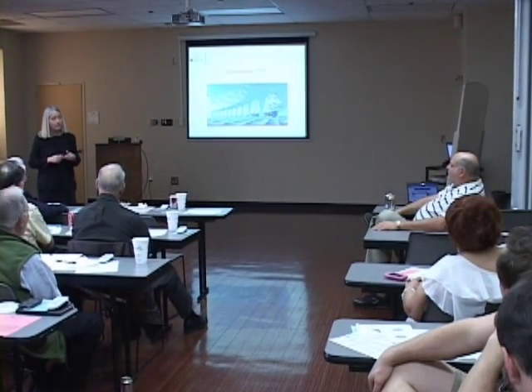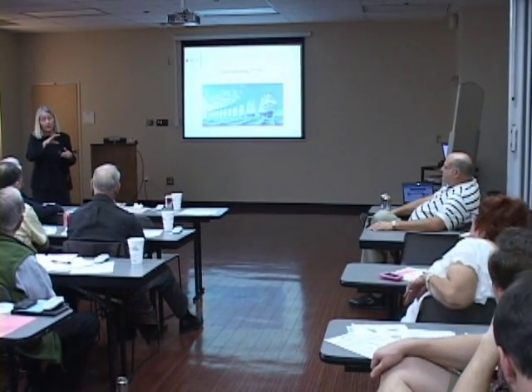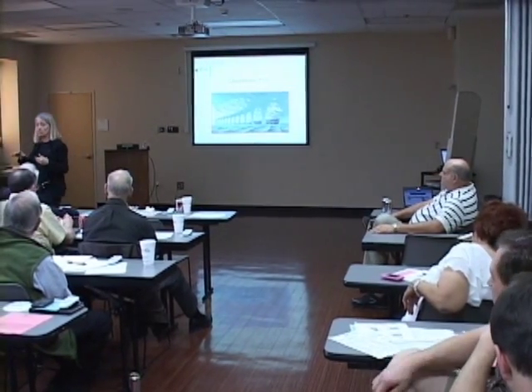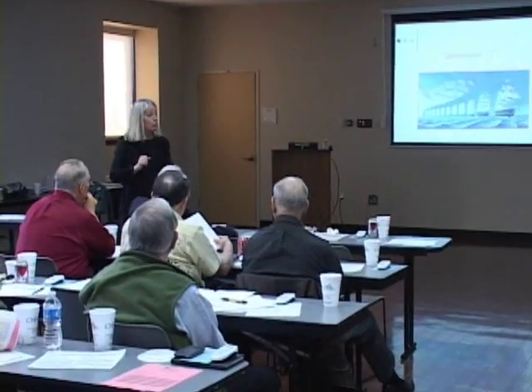Black? Black. Yeah. Okay, well, another thing that can happen when you expose an image intensifier: you don't want to expose an image intensifier to the direct beam because you can burn the phosphor. So normally we don't just step on the pedal and let the direct beam hit them without some sort of a phantom in the way. I saw you do it this morning, I was going to say something, I thought, I don't know. But normally when you expose an image intensifier, do a quality assurance test or anything like that, you want to put something in the beam to attenuate it so you don't burn out the phosphor. So you may have burn spots in your phosphor.